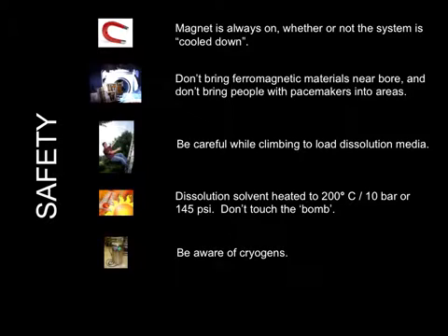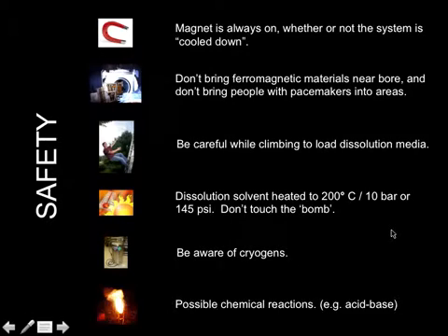And as I mentioned, be aware of cryogens. If there is a situation where there was a quench, then I mentioned about 100 liters of helium and 100 liters of nitrogen. That would turn into about 800 times that and get released into the room. These systems aren't vented, so you probably want to get out of there if all that gas is released. It's not really that much, I don't think, but still, it's something to be aware of.